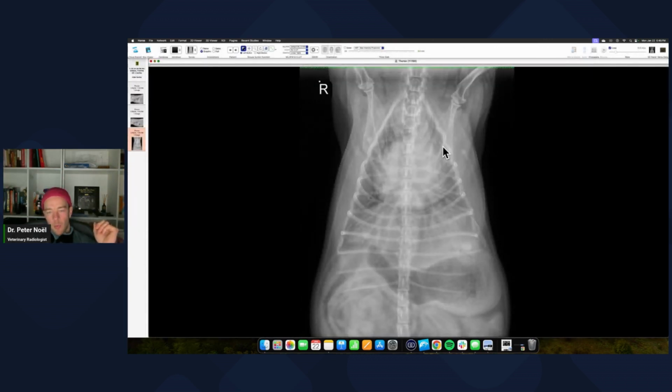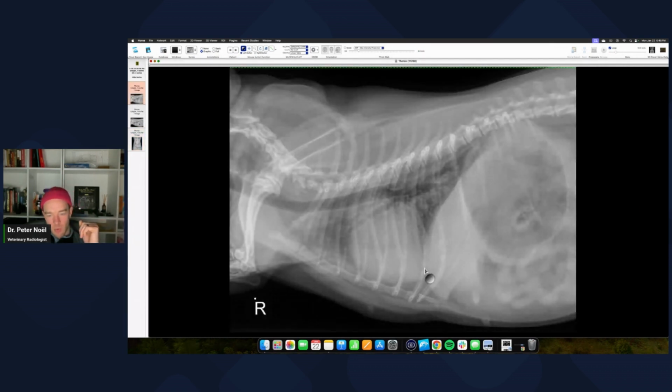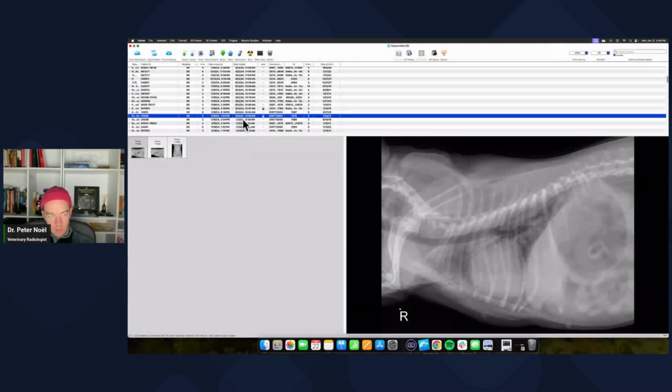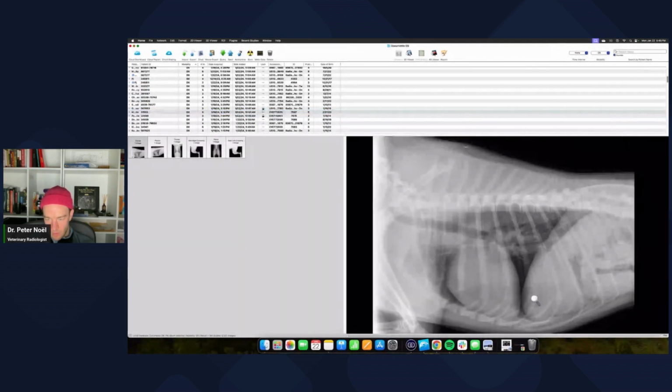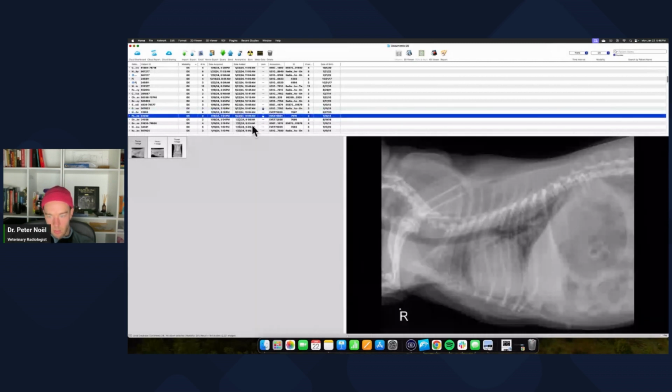The MPA bulge would be 1 to 2 o'clock. So it had a good bulge on this one. I think this was a follow-up radiograph, but this is what I wanted you to take away from it. This right here, you should worry about the fact that this dog has, right? So this is normal right lateral view, stuck. Left lateral view is rotated. Right lateral view on this study, it's rotated dorsally.